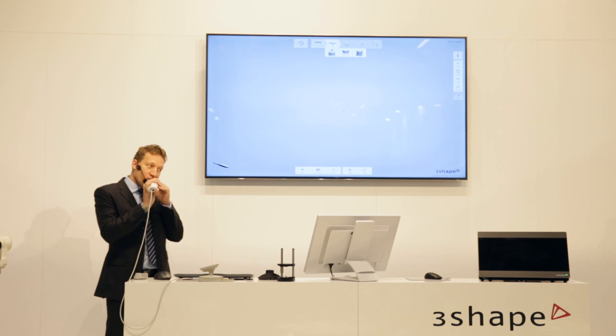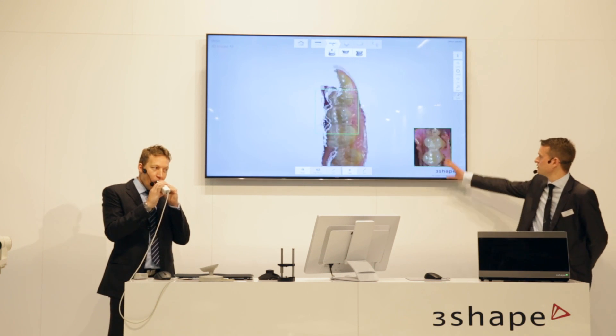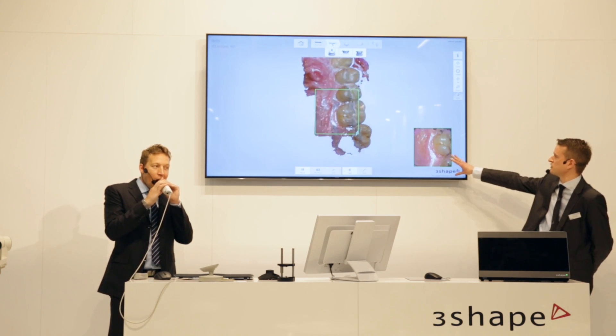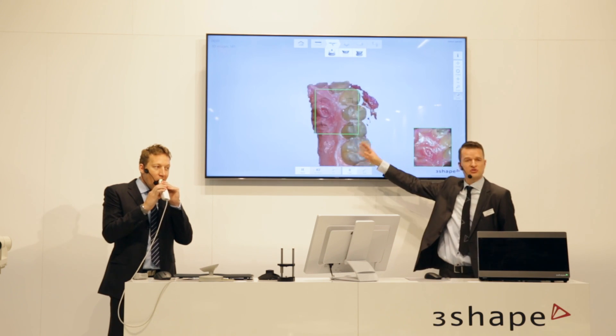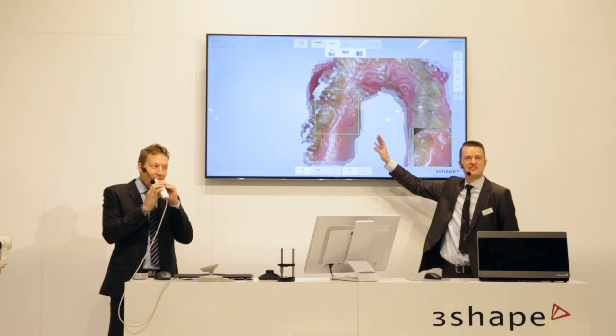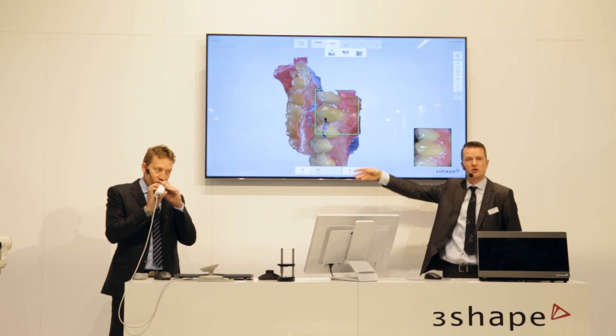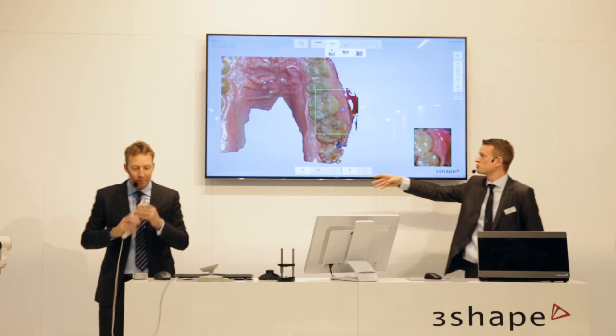I'll be looking on this screen. You can see while Tyson's scanning here with the same speed — you see each picture down here. Try to see the frame rate, and especially try to see how fast it builds up here. It is insane. There's no match for this from any intraoral scanner on the market. And you saw there was no need for preparations — no need to spray.